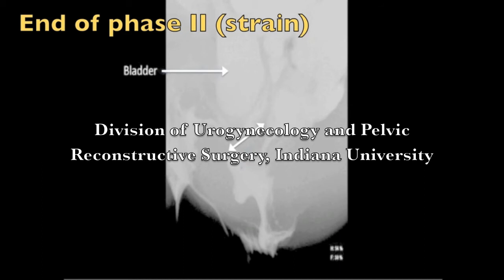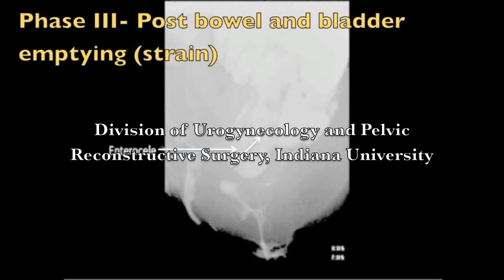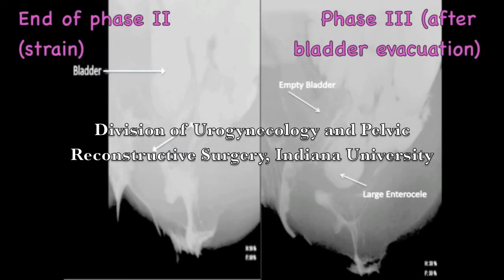This is another patient who had a DCP performed because of a chronic history of pelvic pressure with bowel movements. The defecation and post-defecation images were normal. Note the full bladder and the normal-appearing rectovaginal space at the end of the defecatory sequence. After the bladder is emptied, this space is filled by a large enterocele, and widening of the rectovaginal space caused by the enterocele is noted. A comparison of post-defecation images with and without bladder emptying demonstrates the importance of sequential organ emptying.